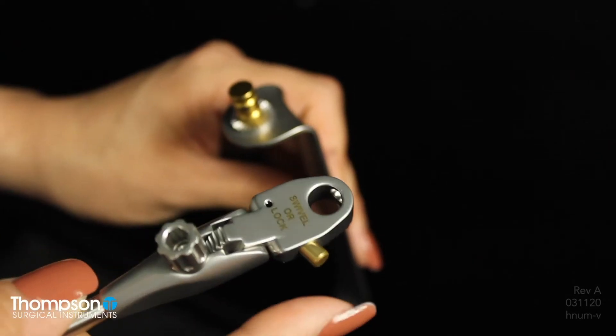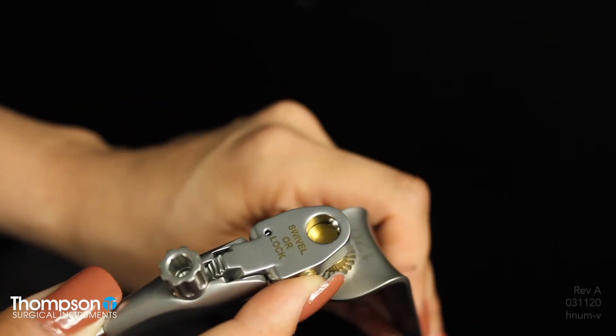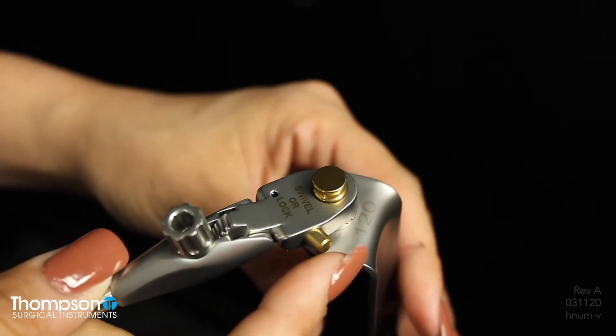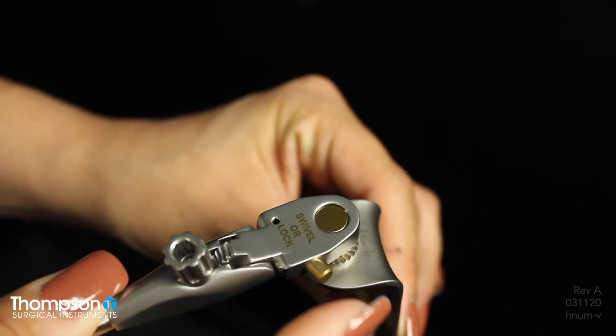Thompson's retractor handles achieve precise, consistent retraction in a variety of different ways. Using our patented S-lock handles and blades, you can switch between swivel and locked positions by pressing the plunger and adjusting the position of the blade nipple up or down.